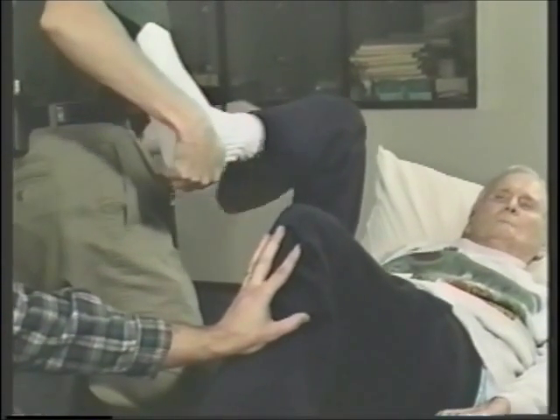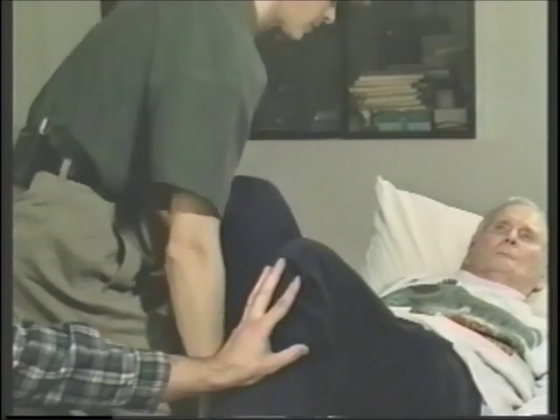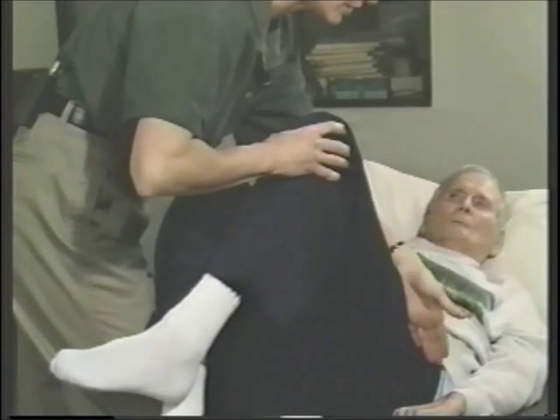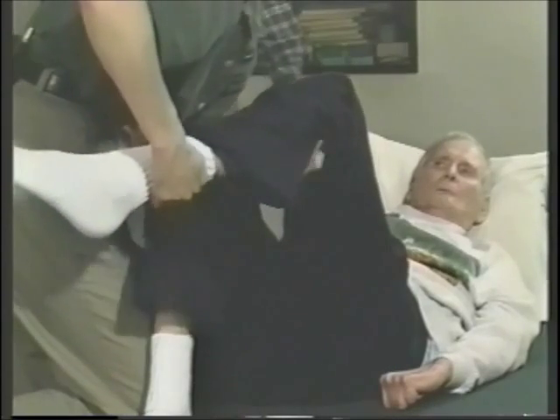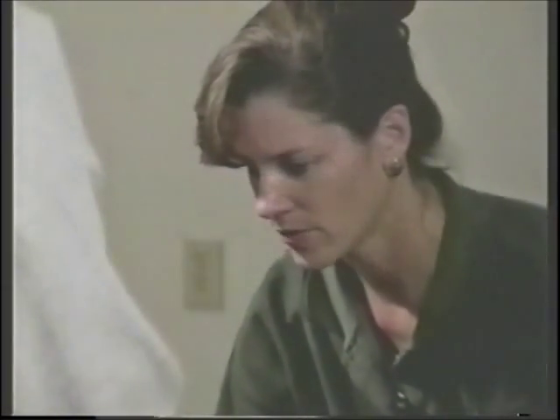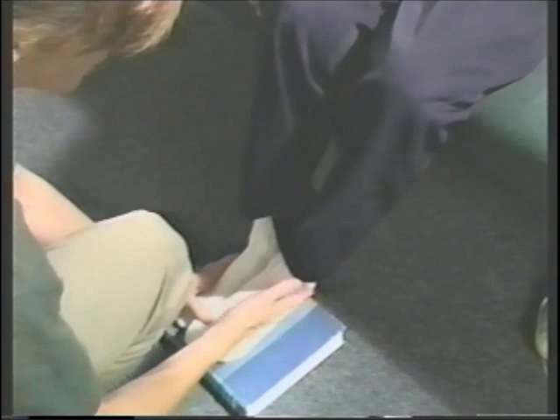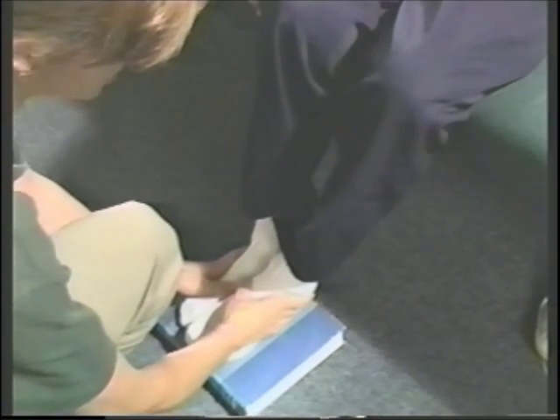About 90 degrees on this side, and his leg is in neutral rotation. The main problems we notice are limited hip range of motion on his left, limited hamstring motion on both sides at 90 degrees, hip rotation tightness, and good ankle range. From the mat assessment, he did not have enough hamstring length to come out much further onto foot plates, so we'll accommodate that by angling the foot plates to suit his needs. Because he has an external hip contracture, we need to bring this foot closer to his right foot.